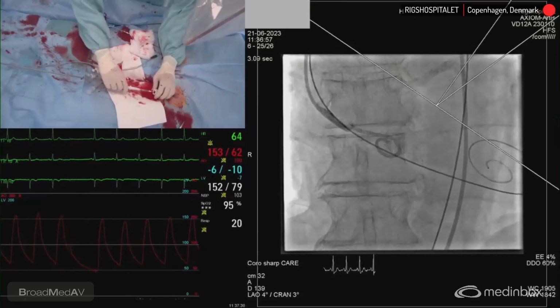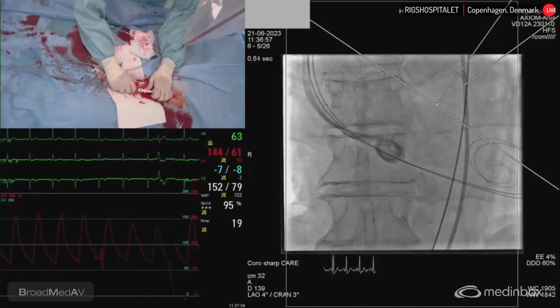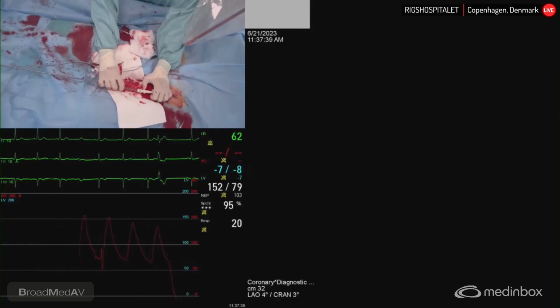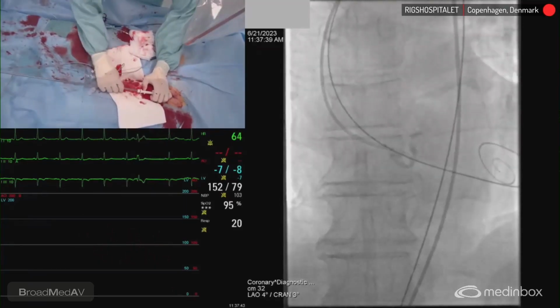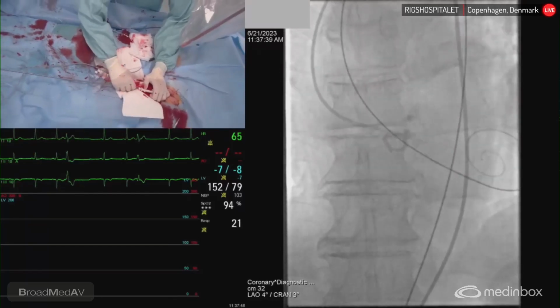Flush port 6 o'clock, okay, that's good. It's going. So there's a small loader, and Alejandro pushed that a little bit in. Now he pushes the 30 centimeters device in, and then after that he will pull back on the loader. Yeah, needs a little bit of force.